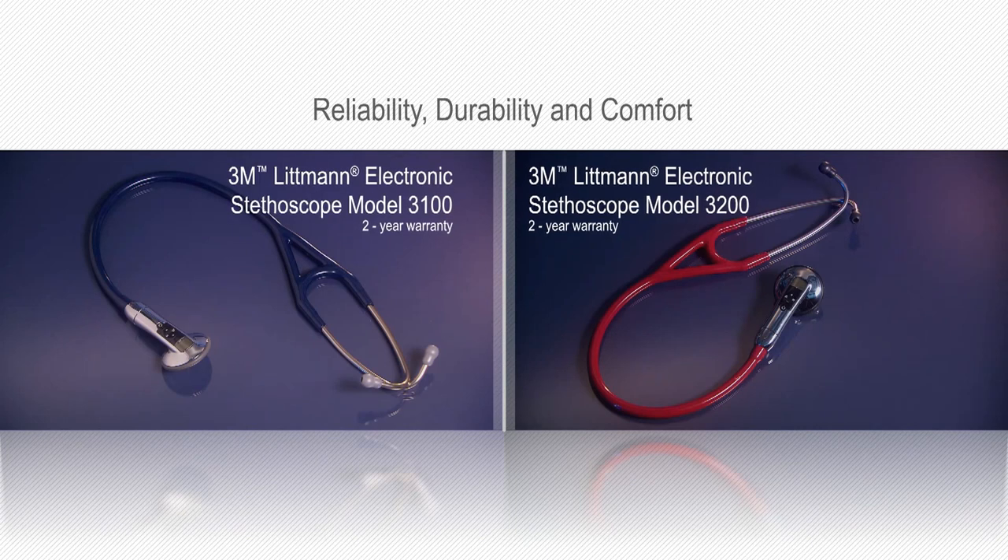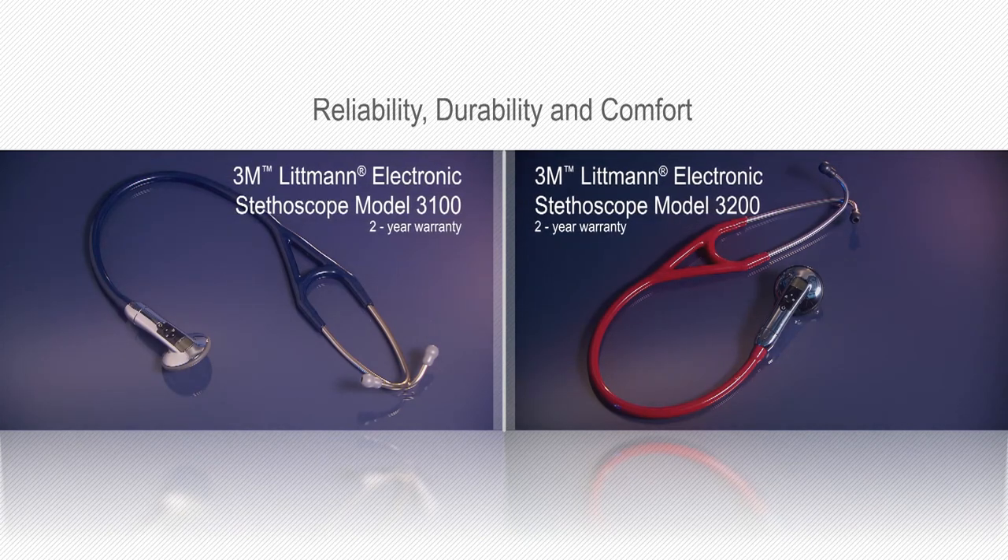Experience the reliability, durability and comfort of a Littmann Electronic Stethoscope.